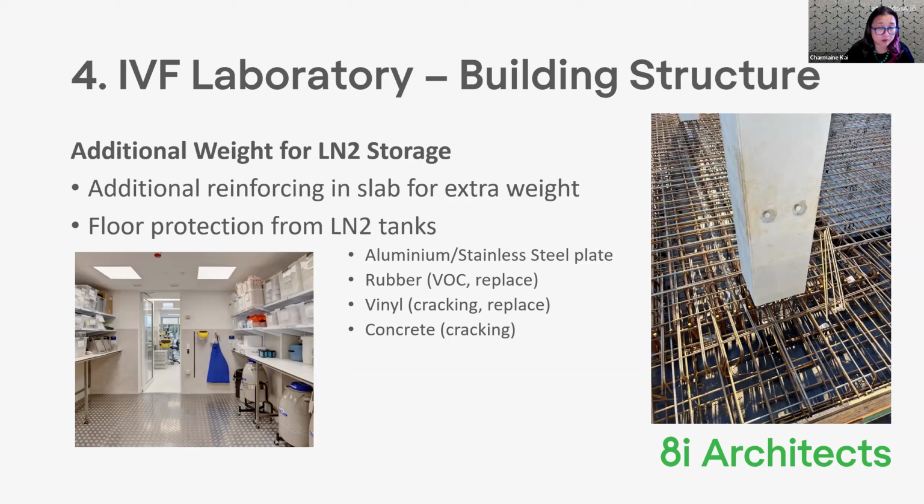They'll be able to take the extra weight of the tanks more than if you're in the middle of a slab and the columns are quite far away from where you put your tank room. So something just to note, when you're looking at putting in a new lab or refurbishing a lab, is where to put your LN2 storage tank room.